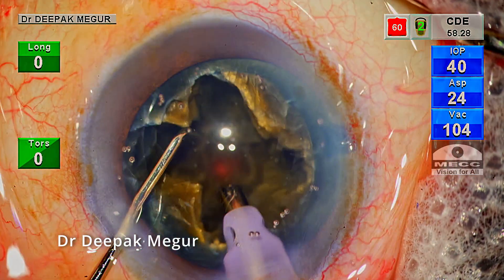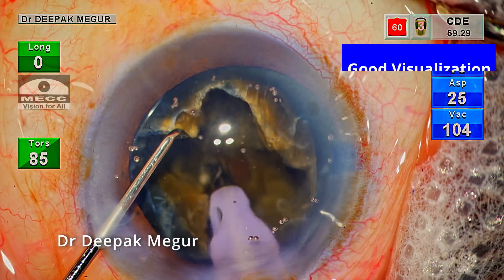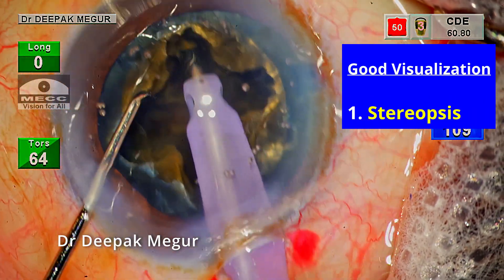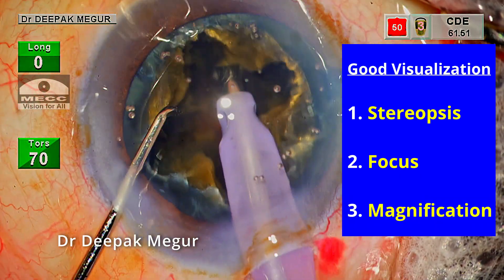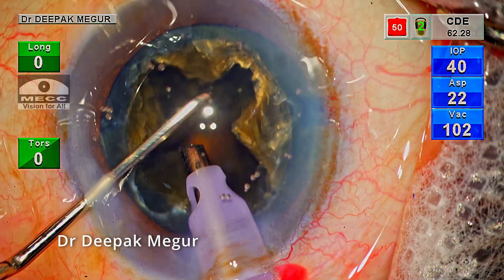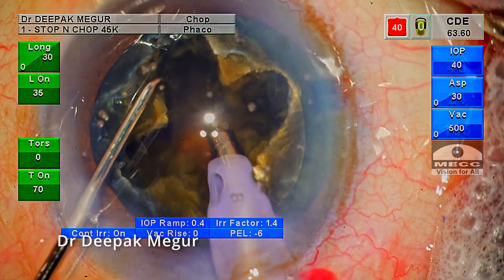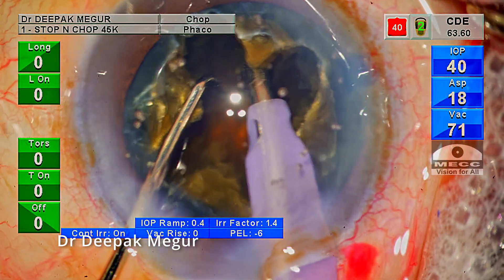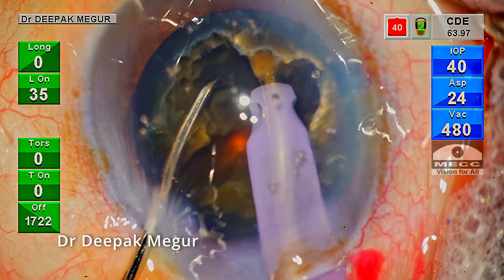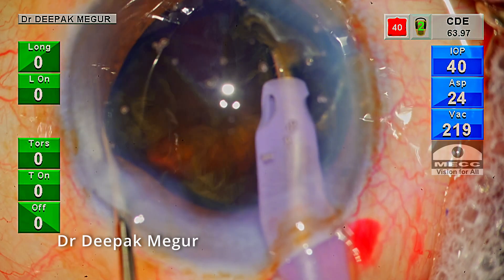The most important aspect while managing these hard cataracts with the four-quadrant technique is to have very good visualization with stereopsis, and assessing the right depth is extremely critical. Having good focus and magnification helps a lot. Once I feel the trench is deep enough, I need to laterally separate the four quadrants by cracking the posterior plate. I'm now switching to chop mode. Under high vacuum with only a short burst of longitudinal phaco energy, I bury the tip inside the lateral wall of one quadrant and then perform lateral separation using the second instrument.